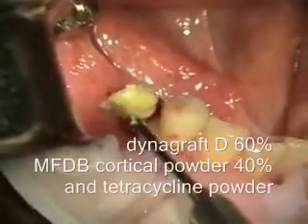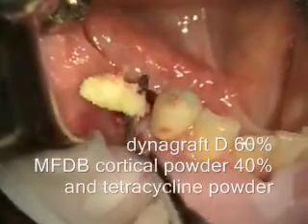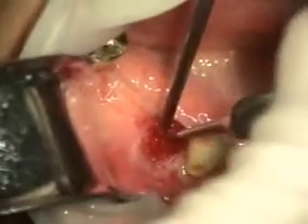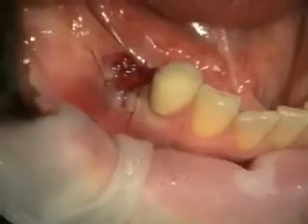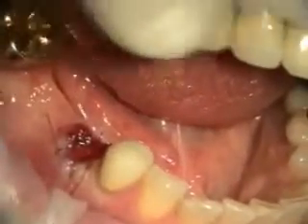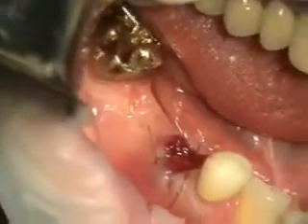We're going to graft the socket with this bone graft material. So we've got the tooth extracted, the site bone grafted, and the bridge cut and the contact polished.